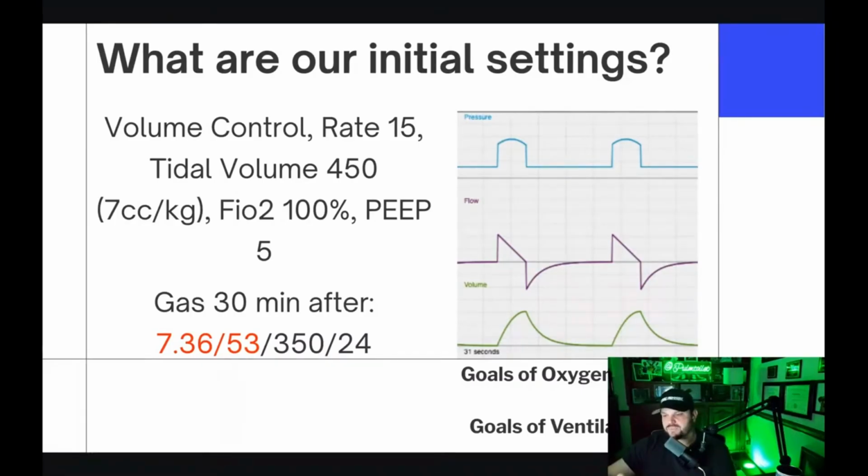So they're going to wake up, they're going to start breathing. If they're breathing like 16, and the rate is at 15, so it's right in the way of them, I'll take that rate down to like 13 or 12 to get the vent out of the way. That way the patient's breathing, doing the trigger work on their own, at least protecting their diaphragm. That being said, you need to make sure the patient's not doing a lot of work, because if you want the ventilator to do the work of breathing because they have pneumonia or whatever it is, then you don't want them to do most of the work of breathing, right? So it's a trade-off, but I want the patient to do the least work of breathing.